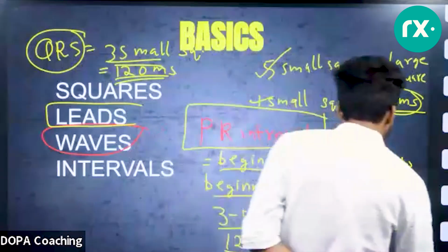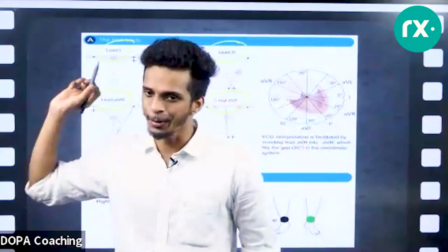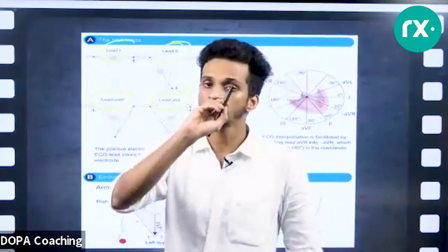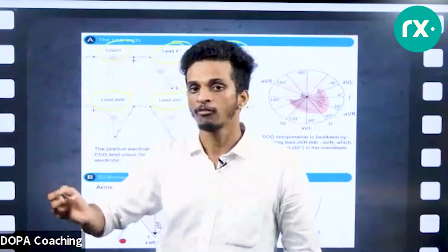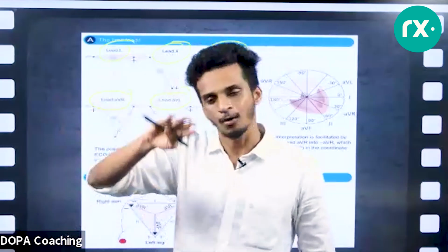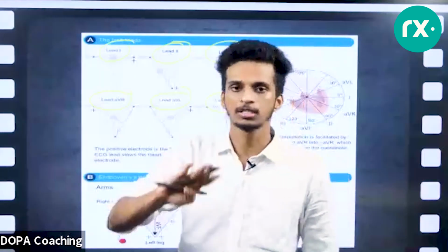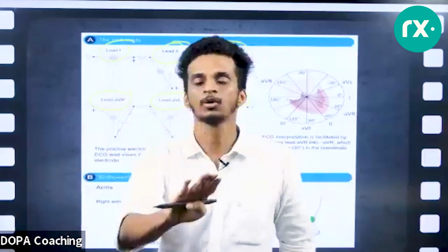So with these basics, we are moving on. Once again, I'm saying these are not the only basics we have. We can explain how the isoelectric line is formed in ECG, why the P wave is a positive deflection, why Q occurs before R. All those have reasons. But for the time being, in a 1 hour session, this is what we need. And when you deal with a patient in casualty, this is the only thing you need.